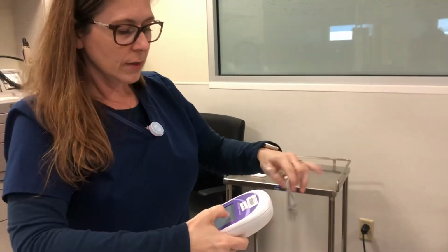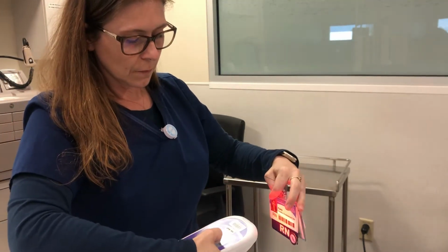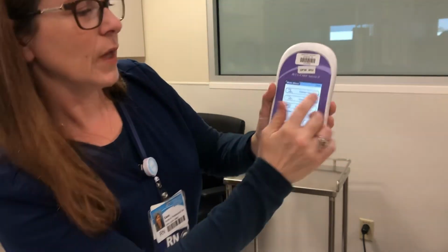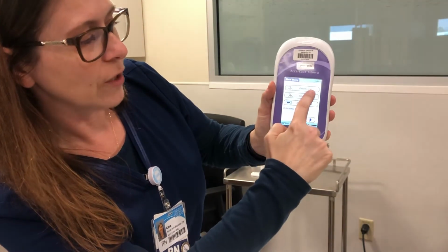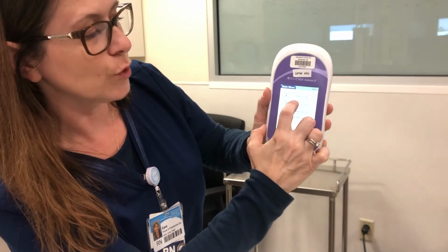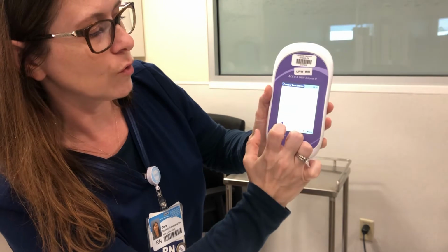My operator ID. Now, it's going to ask you, do you want to do patient test, control test, or review results? And for this, we're doing controls. We're entering our controls in.